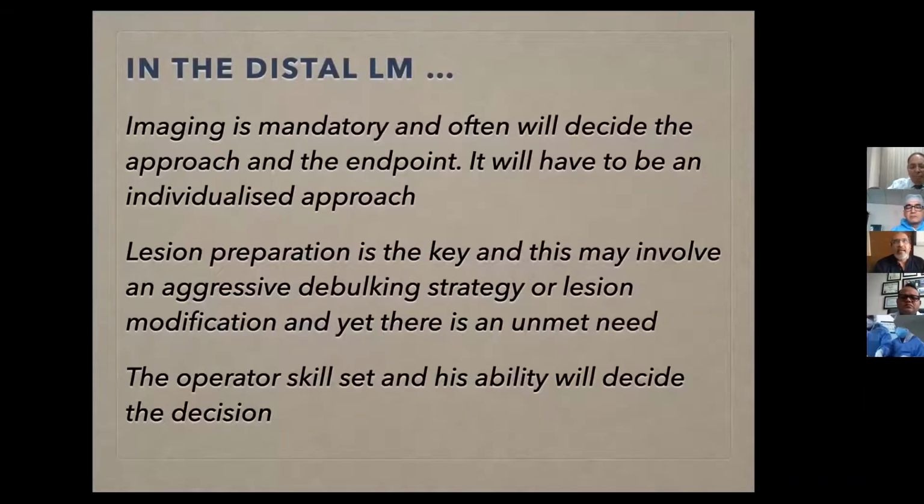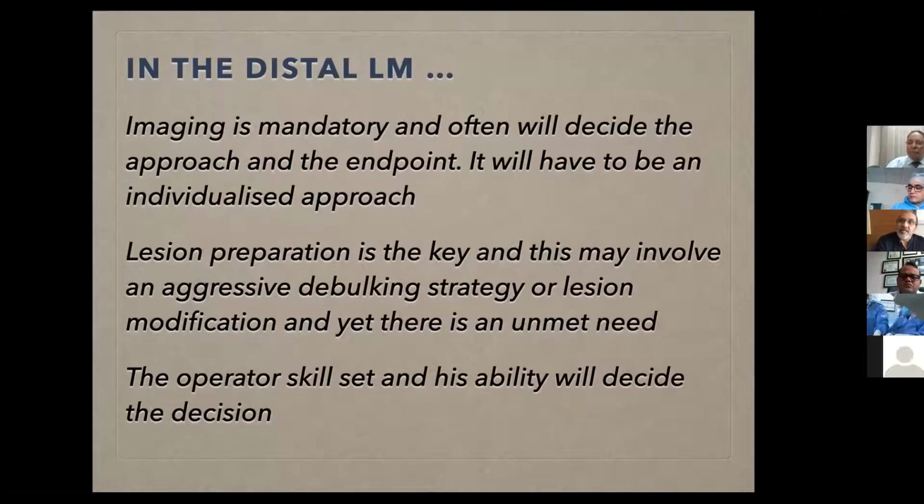I think imaging is mandatory, often will decide the approach and endpoint. It'll have to be an individualized approach. Lesion preparation is key, based on the images. And I think operator skill and his ability to decide and negotiate these images successfully into a procedure is the key to a good left main angioplasty.